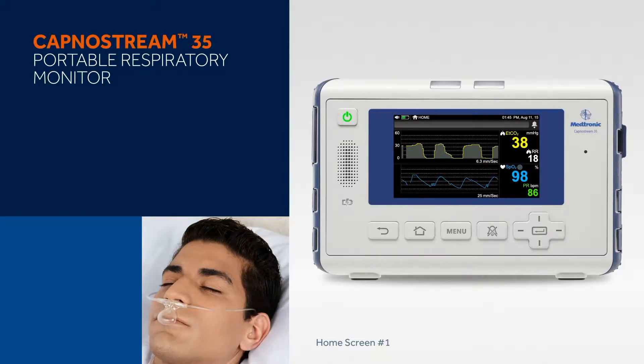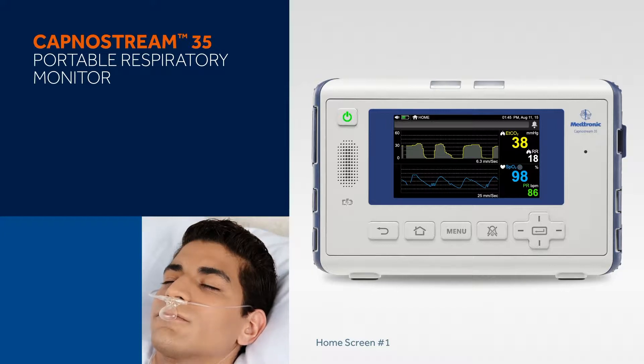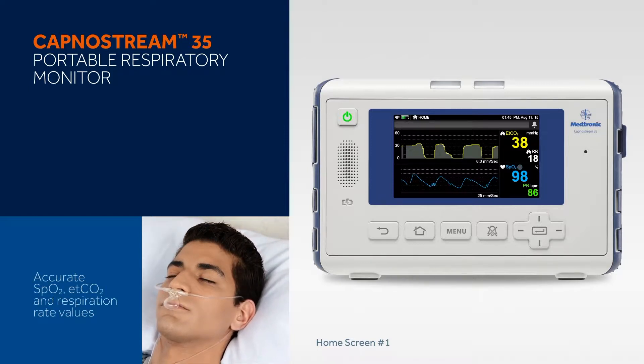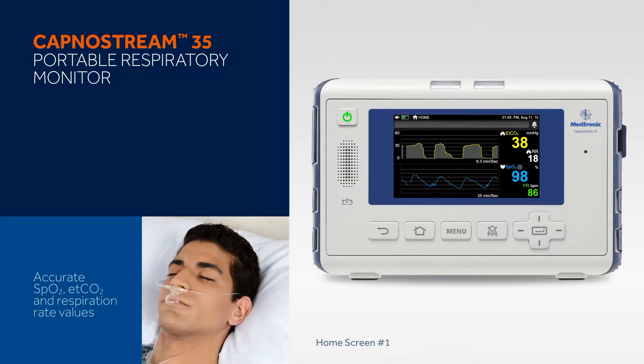The KapnaStream 35 Portable Respiratory Monitor combines Nelcor Pulse Oximetry and Microstream Kapnography technology to provide accurate SpO2, end tidal CO2 and respiration rate values with crisp waveform readings for a wide range of patients from neonates to adults, whether intubated or non-intubated.